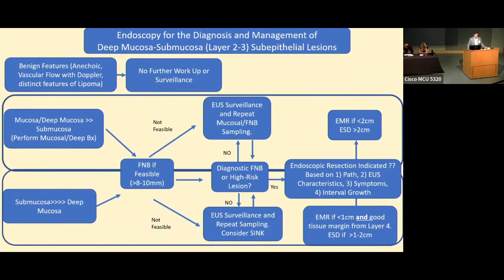If it is not feasible to perform FNB on the lesion, based on its ultrasound characteristics, you'll either put those patients into a surveillance program to see if they graduate into a higher risk lesion.